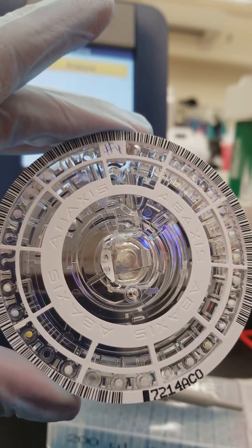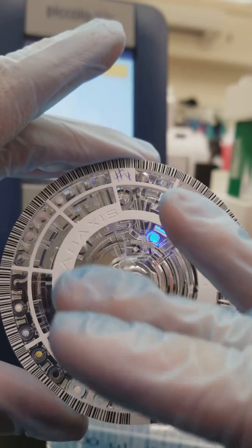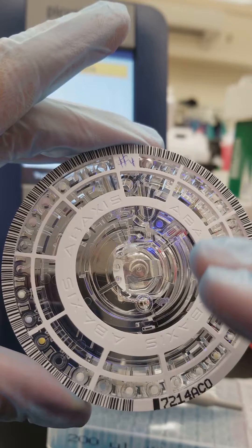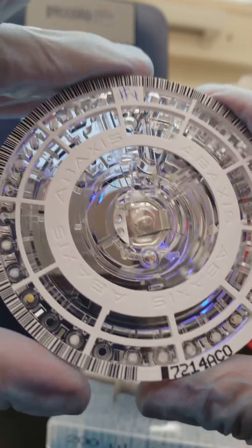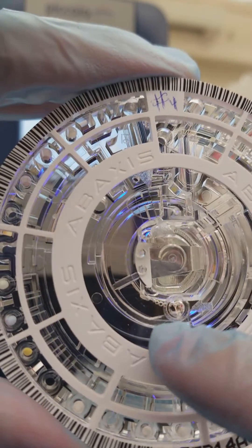You need to make sure not to touch the top part of this disc when you're trying to put the specimen inside. You don't want to get bubbles.